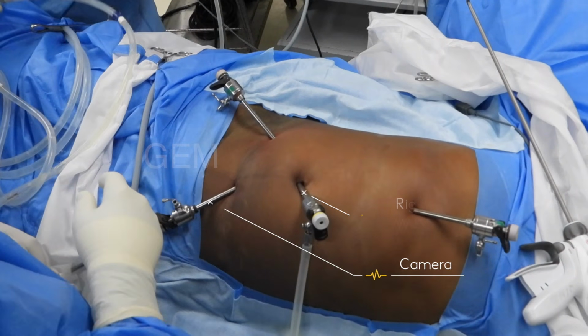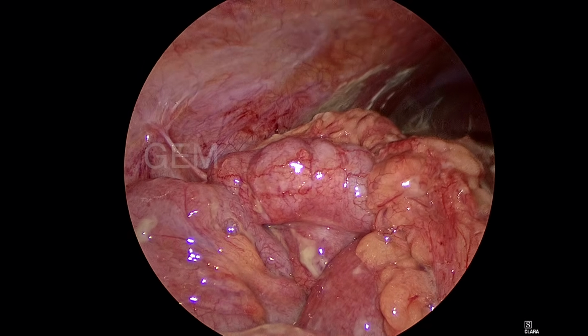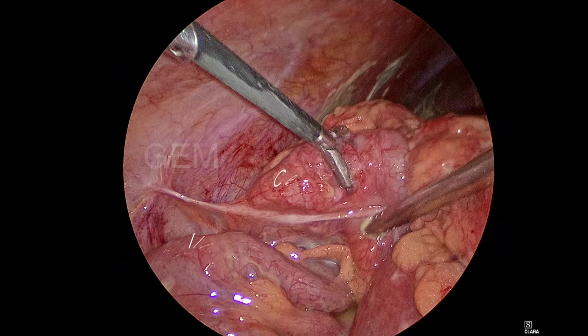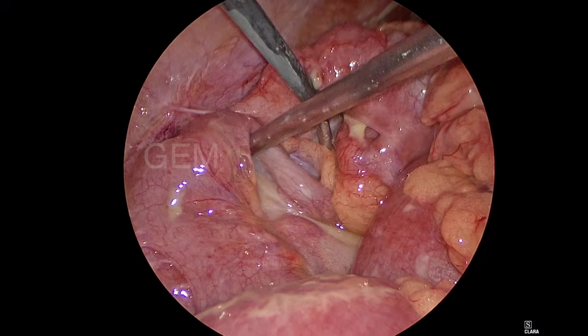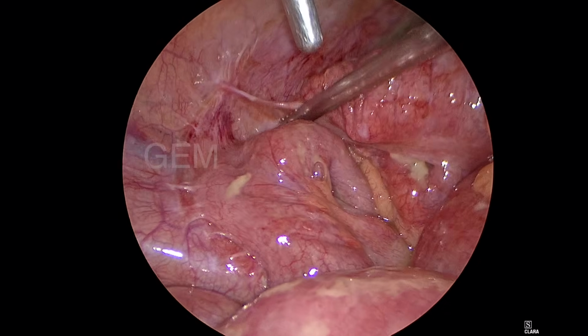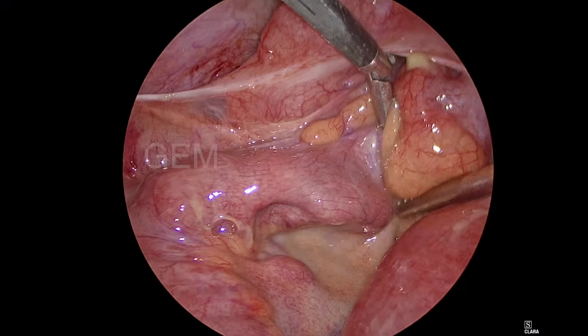So this is the camera in the suprapubic port, right hand working through the umbilicus, and left hand working in the right iliac fossa. This is the three-port setup. The epigastric port is the entry point, because of the mass formation, I don't want to go in the umbilical region. This is the cecum and ileum. Identify the structures: the ileocecal junction is seen, and that is the fixed portion of the terminal ileum. Everywhere there is collection.